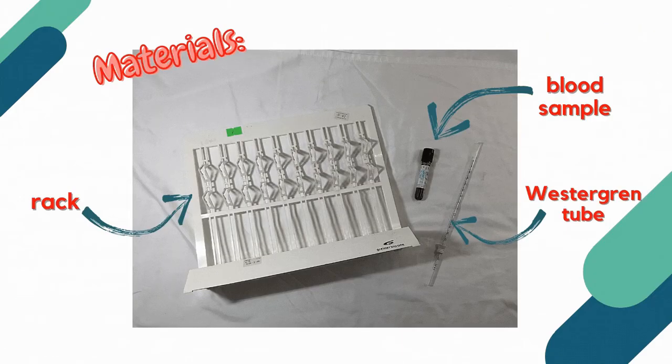The following materials will be needed for the procedure. First, we have the rack. Next, our patient's blood sample. Preferably, a blood sample that is anticoagulated with 3.8% sodium citrate. And lastly, we have the Westergren tube.